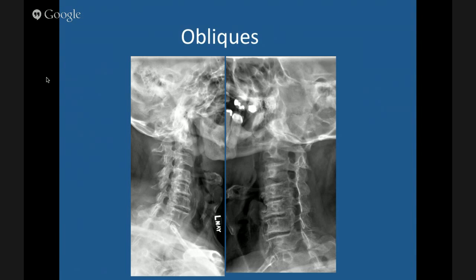When you're looking at the left oblique in the AP projection, it's the right neural foramen you're looking at. Conversely on the other side, it's the left side. You can see nice open foramina on one image, but on another you see something sticking into the foramen — that's bony hypertrophy or osteoarthritis at the uncovertebral joints, or joints of Luschka, sticking out into the foramen, which is what causes impingement to the exiting nerve roots. The films are done AP, and they always put the marker on the side closest to the film.